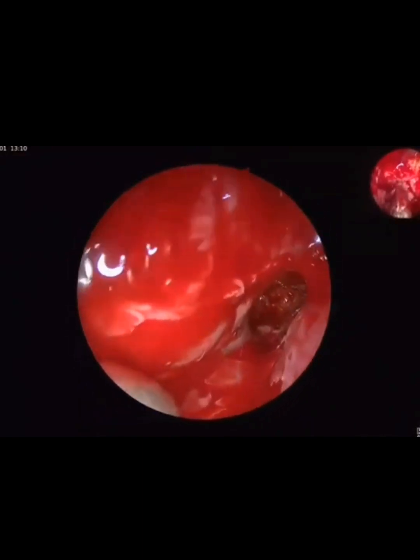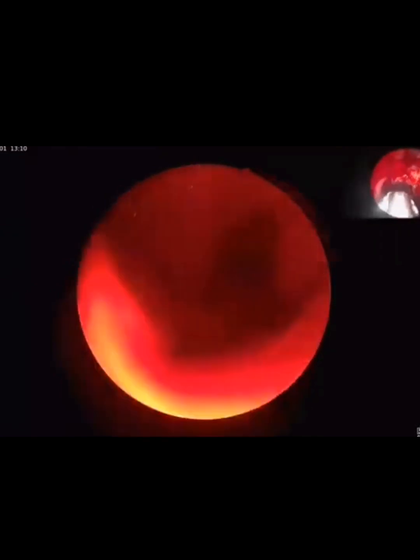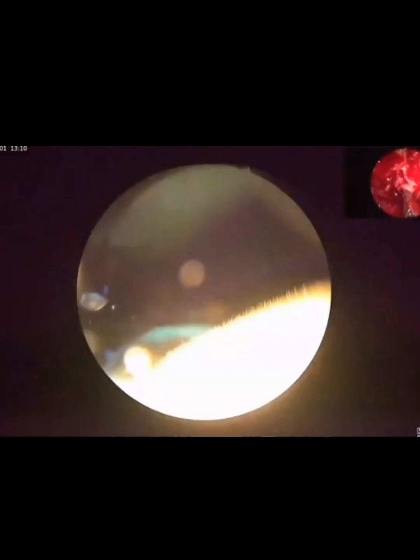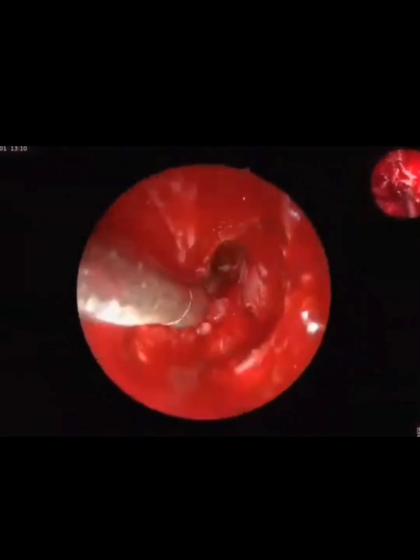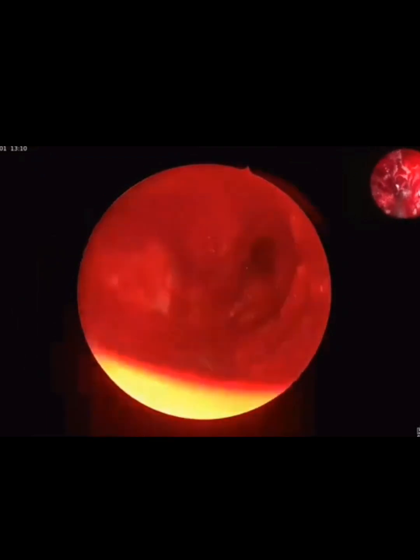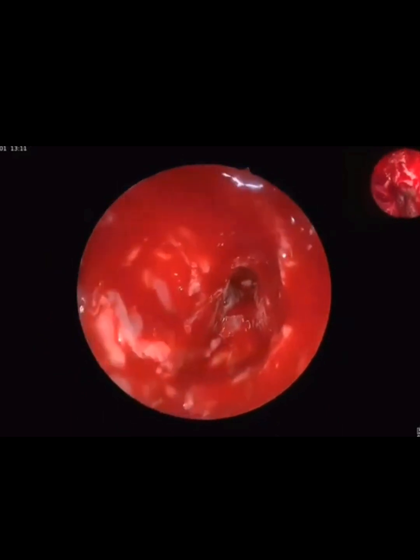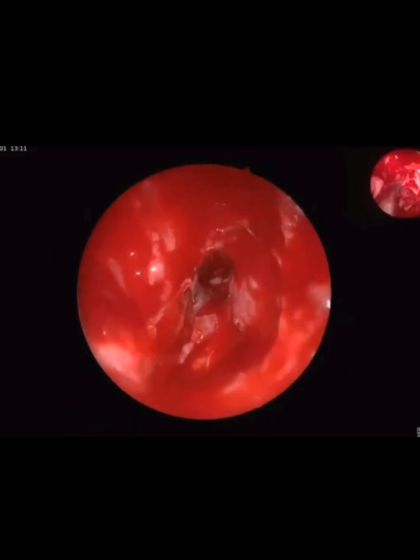Now you can all see the frontal sinus. Yes, we are within. Very good. Clear? This is the supraorbital recess. Now the question is, where is the anterior ethmoidal artery? See, this is frontal sinus. This is supraorbital recess. So the anterior ethmoidal artery is immediately caudal to the supraorbital recess here. So it is the advantage of intact bulla technique. You never injure the superior anterior ethmoidal artery.